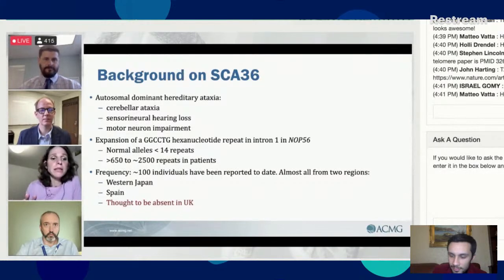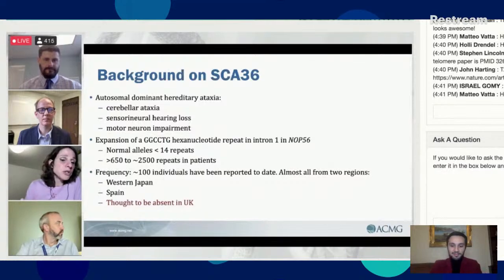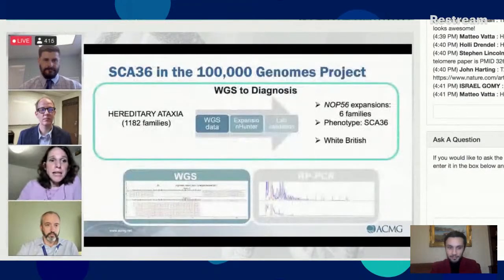But most importantly, it was thought to be absent in the UK because a previous screening about 5 years ago of patients with ataxia in the UK was negative. So there isn't a diagnostic test for SCA36 currently in the NHS. So we went on to analyze the SCA36 expansion in patients recruited to the 100,000 Genomes project, and this is really a nice example that shows you how whole genome sequencing can quickly lead to a diagnosis.